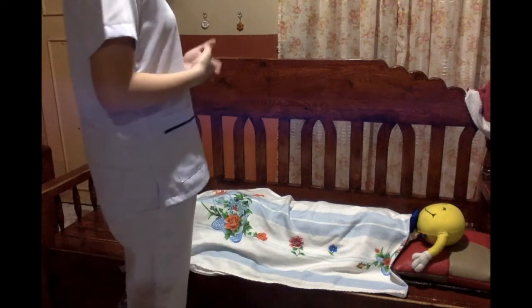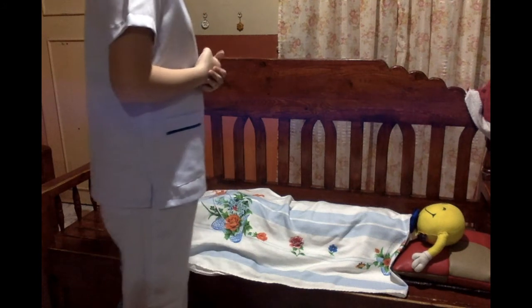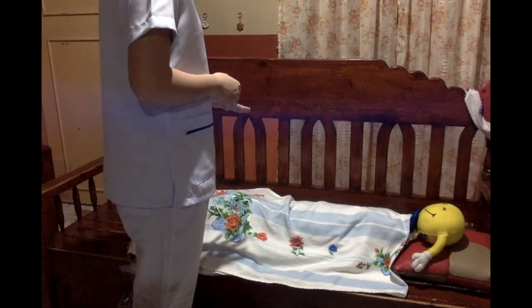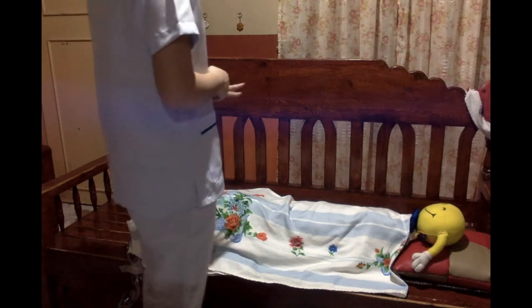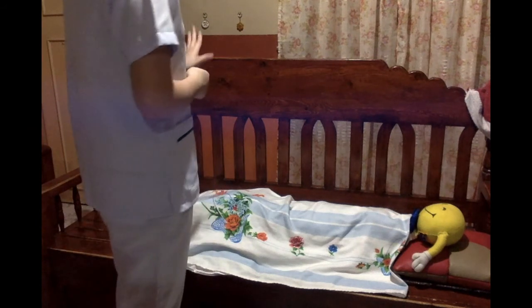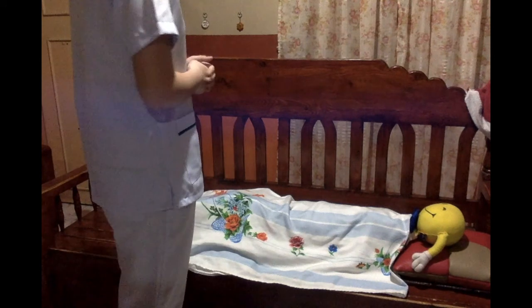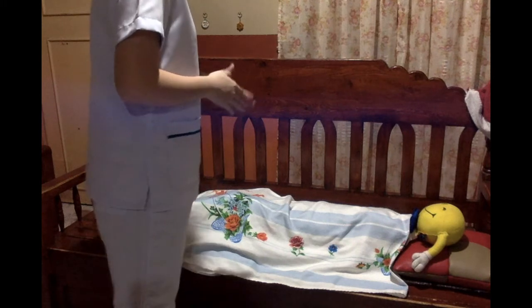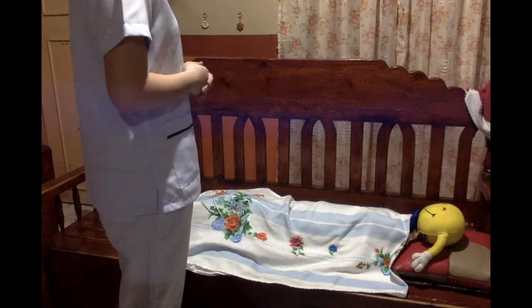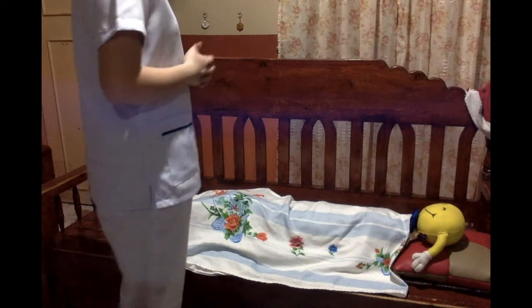Magandang araw po, Ms. Miley. Ako po dito si Student Nurse Alex. Kamusta na po kayo? May mga kaiba po ba kayong nararamdaman? Masakit po ba? Hindi naman po. Okay po. So, bali, andito naman po ko ngayon para po tignan at linisin po yung ipinasok po natin sa'yo, pati na rin po yung peta po ninyo. Kailangan po natin itong gawin para po bawasan o matanggal po natin yung mga mikrobyo na maaaring magdulot po ng infection sa inyo. Ayos lang po ba yun? Okay po. Salamat po.